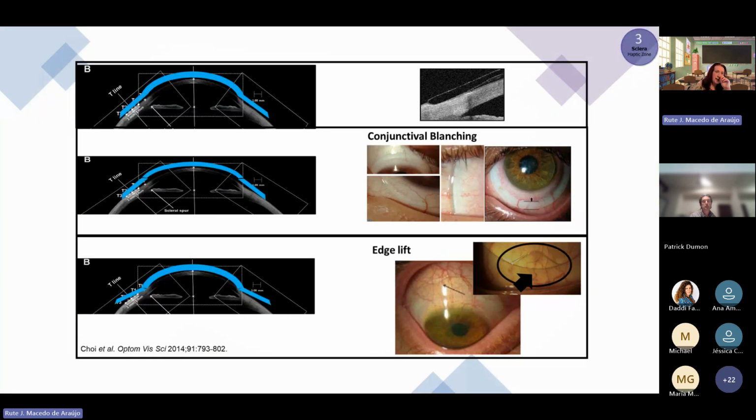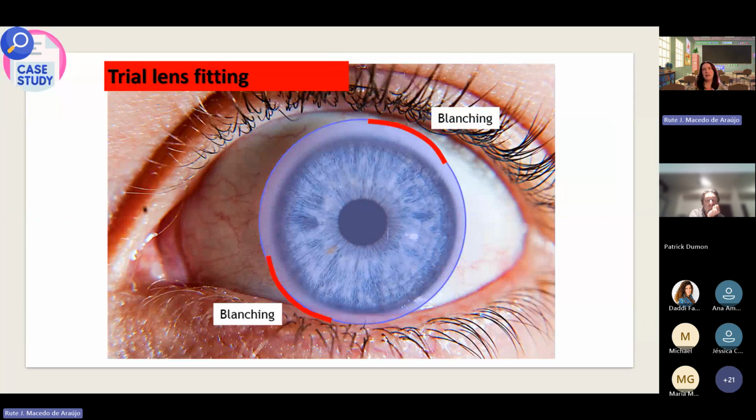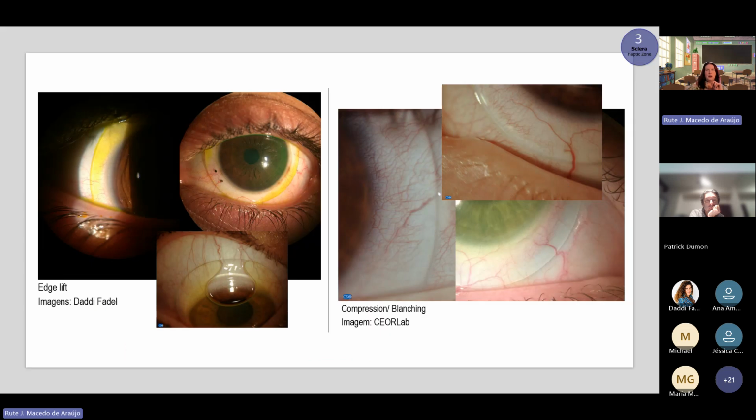About the scleral zone, we can have three things. The lens is well aligned, or the lens is not well aligned, and in that case we can have conjunctival blanching if the lens is too tight, and this can be over the whole landing zone or in some specific areas, and also in other cases we can have edge lift. So this is a case where I inserted a spherical landing zone scleral lens, and we can see here that there is some blanching in some areas, some of them because of this small pinguecula, etc. But there was blanching, and by doing that, I saw that the sclera of this patient was toric, so we fitted the toric lens and the fitting improved a lot.